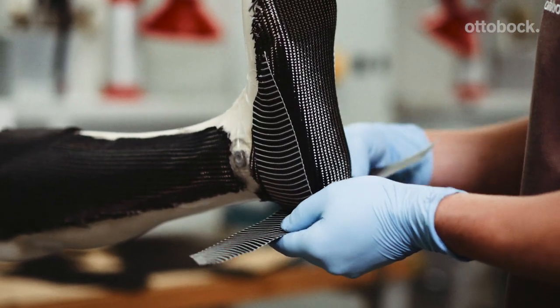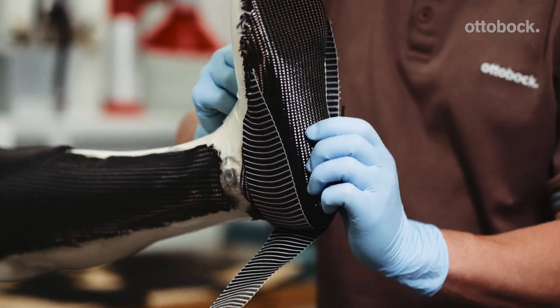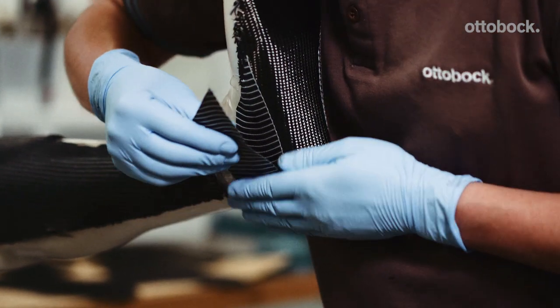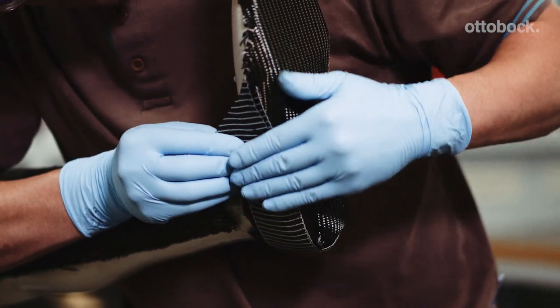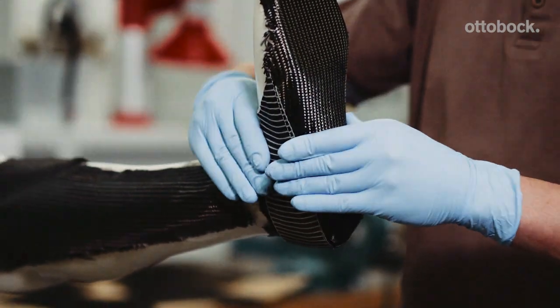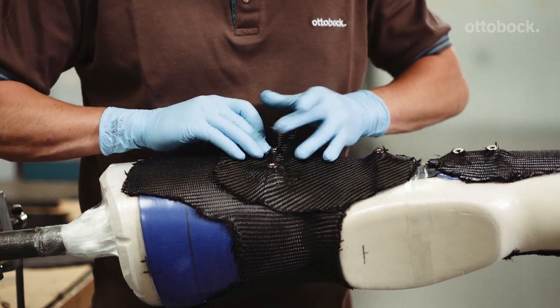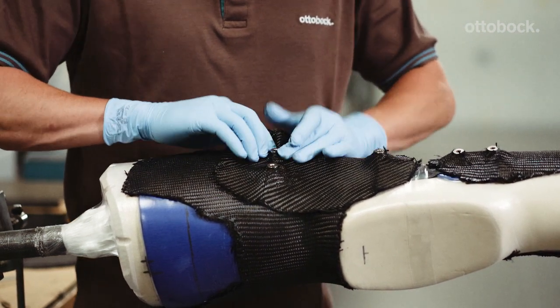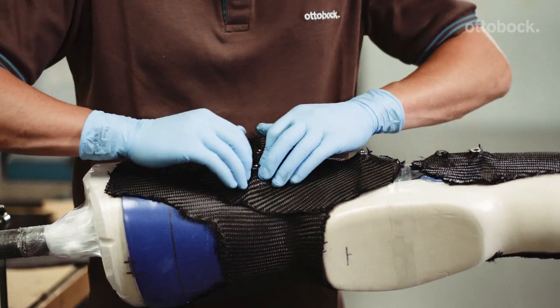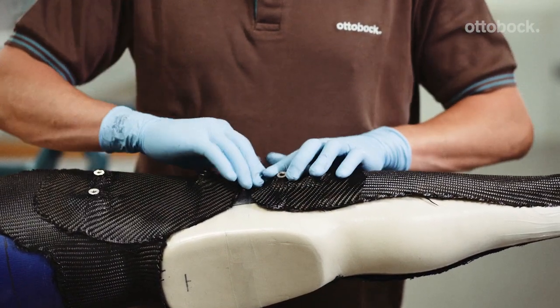Two layers of UD carbon are applied around the ankle to reinforce the foot component. The carbon should extend down to the rollover edge. In the area of the anchor nuts, place two layers with a 90 degree fiber direction for joint stabilization. Do the same in the area around the anchor plate.